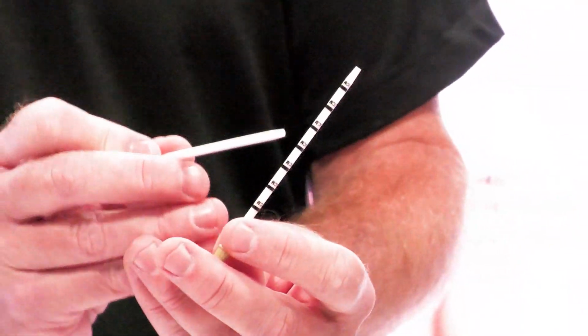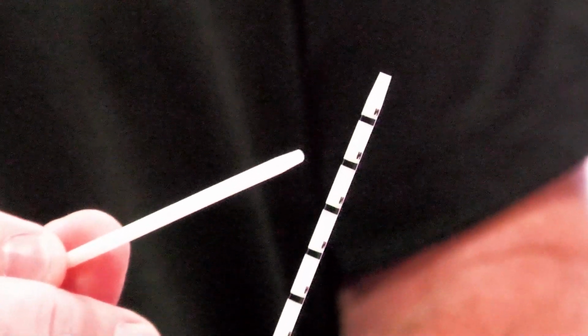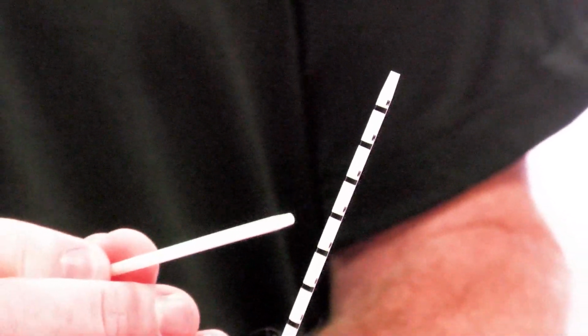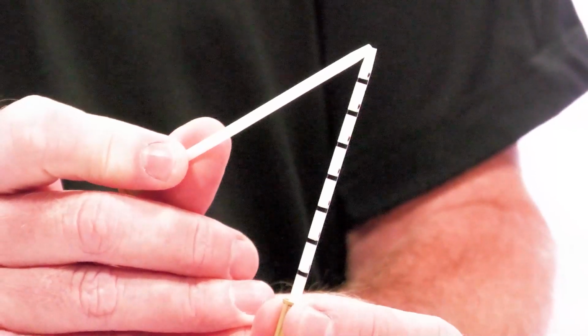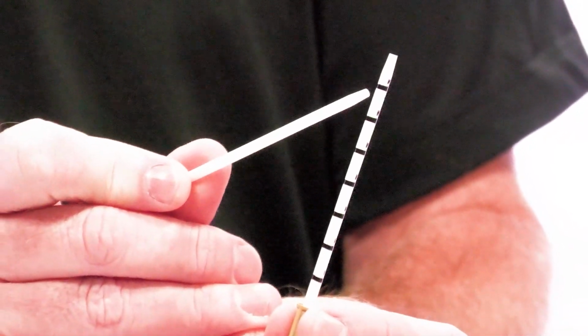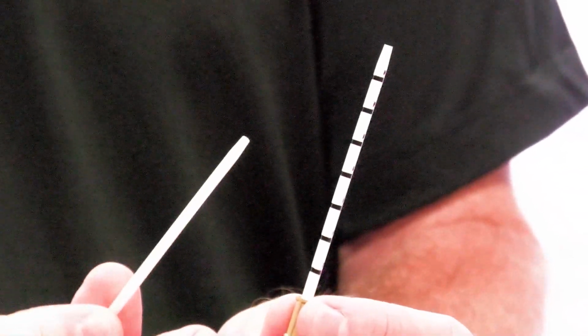It's going to be a little hard to see, but when you have it, you'll be able to see there are little holes in opposite directions all the way down. So even if the catheter at the very distal end gets collapsed, you can still evacuate air through the sides, almost like a Murphy's eye on your endotracheal tubes.